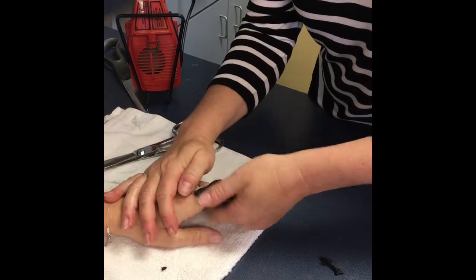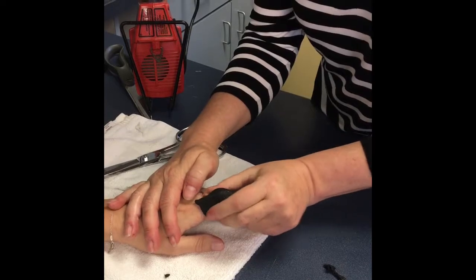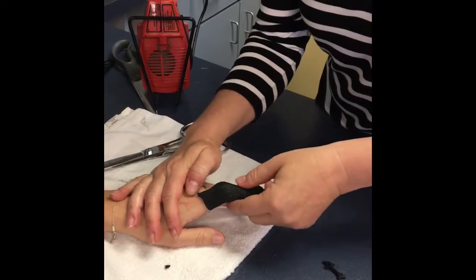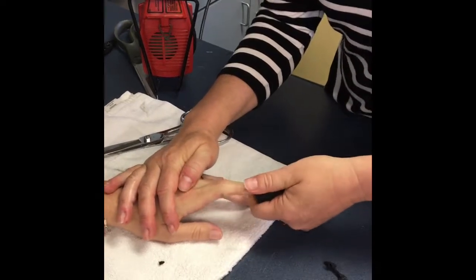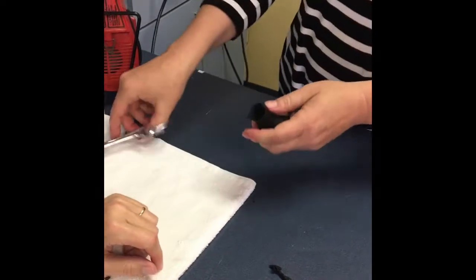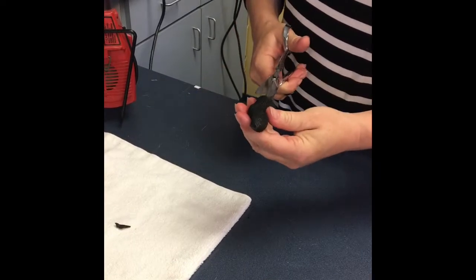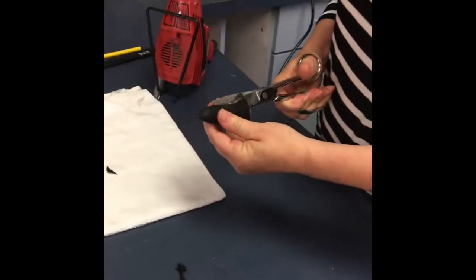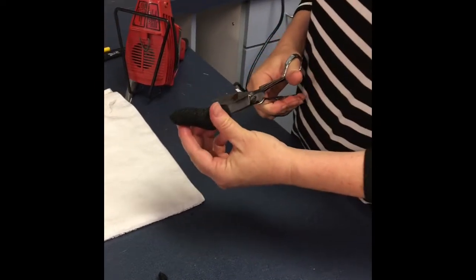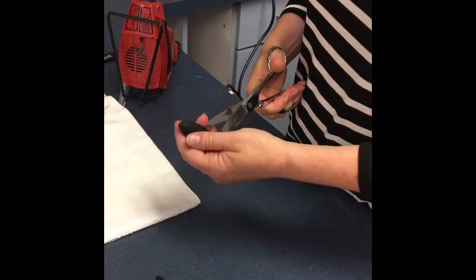Once hard, give it another minute. We're going to slide that off and trim. We're going to cut up the side to expose the volar portion of the PIP to allow PIP flexion for exercise out of the orthosis.